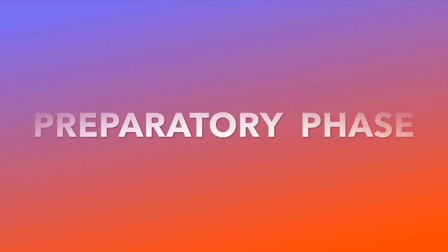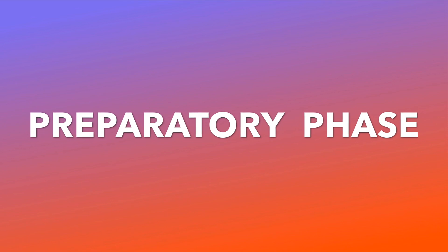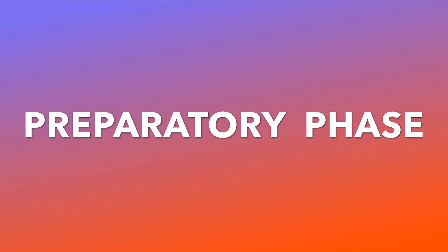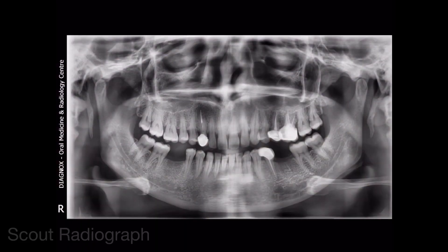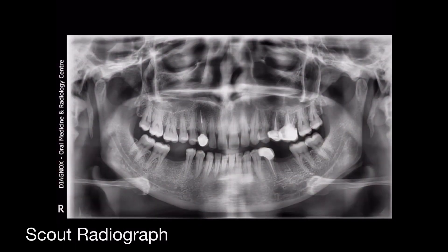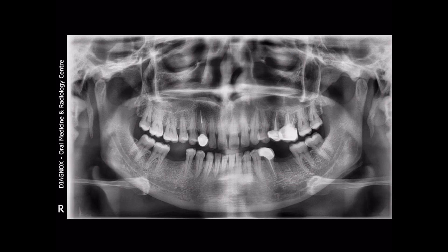Phase 1 is the preparatory phase, in which we take a scout radiograph to make sure the patient's positioning is fine and whether there is any presence of radiopaque calculi, or any superimposition of normal anatomic structures like the hyoid bone in this particular case in the left submandibular gland region. Then we go on to the second phase.